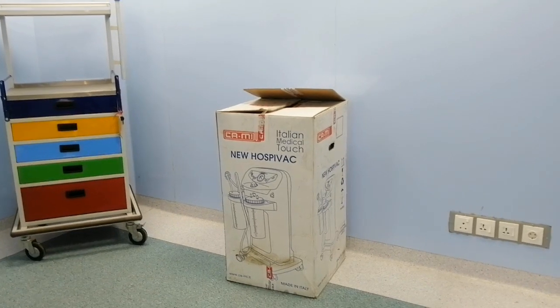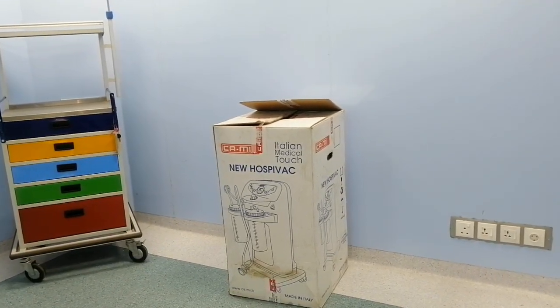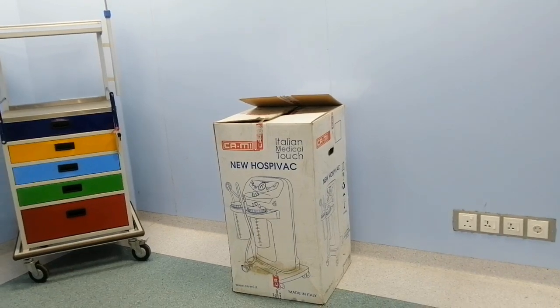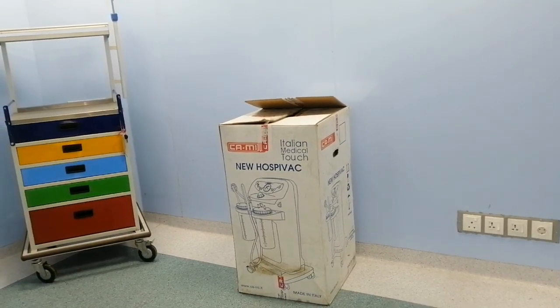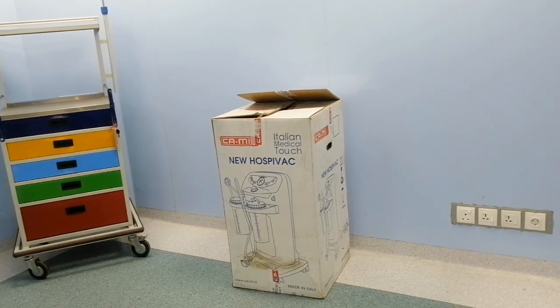Hello guys, welcome back to another video. I'm going to install this suction machine — this is a mobile trolley unit and heavy duty suction machine. The brand of this machine is Cami and the model of the suction machine is Hospivac. So let's get started.